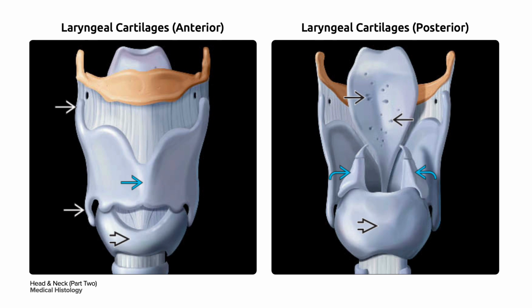The cricoid cartilage in a bold black arrow forms a complete ring, being narrower anteriorly. On your right, the epiglottis has small holes or fenestrations in single black arrow, and the arytenoids in curved blue arrow sit on the posterior cricoid cartilage in bold black arrow.